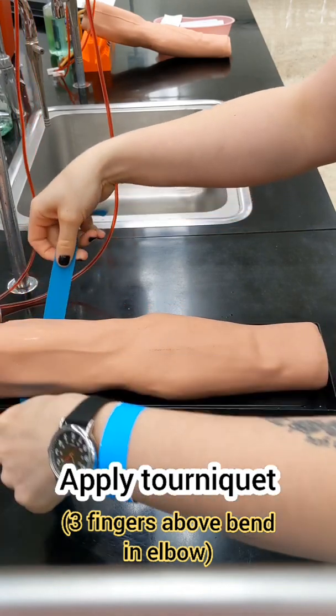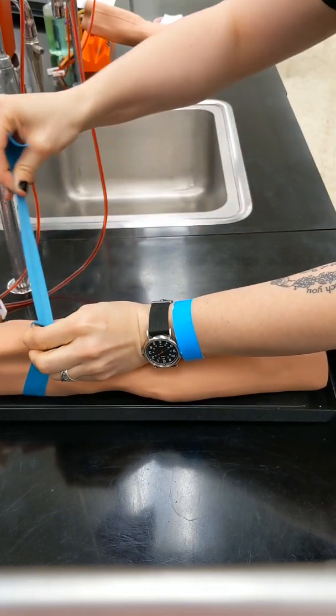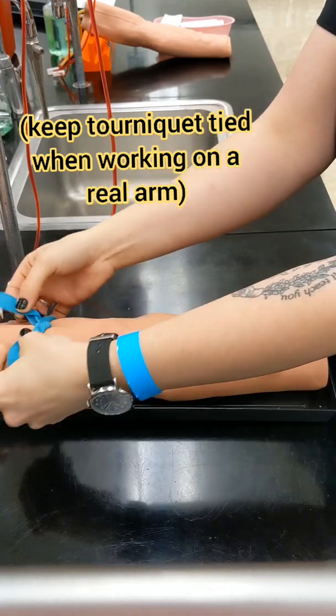Apply your tourniquet three fingers above the bend in the elbow. When you're choosing a vein, your median cubital is going to be the best option because it's going to be the sturdiest and roll around the least.